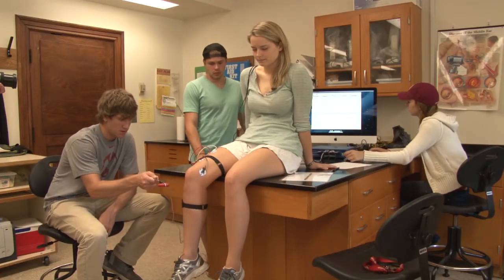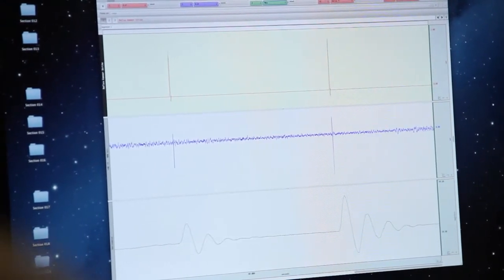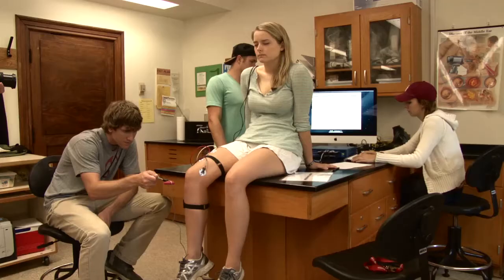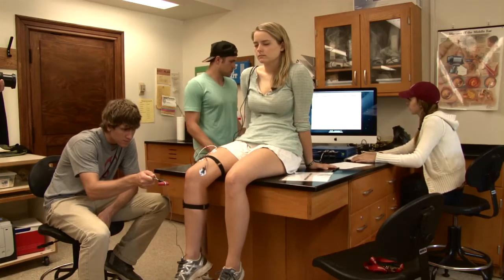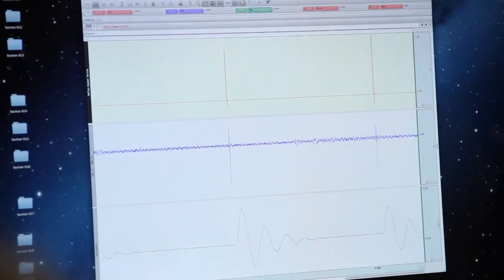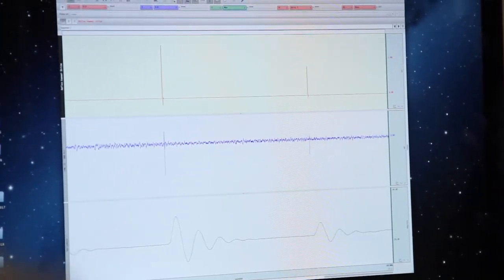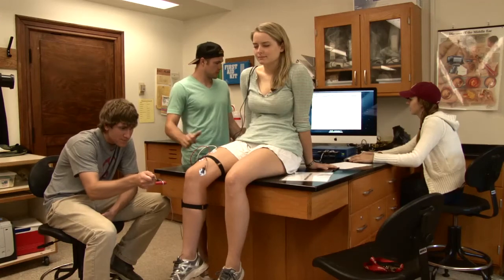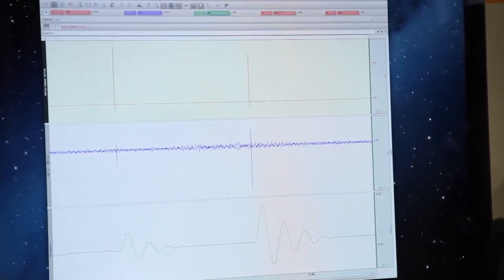We're going to do a control trial, so go ahead and start it and coordinate. The lab manual says to do five to ten trials, but what we're looking for is three good consistent responses. These are all pretty good, but we want three with decent, similar size. These last two are fairly similar — let's see if we can get another one. That's pretty good — go ahead and hit stop.